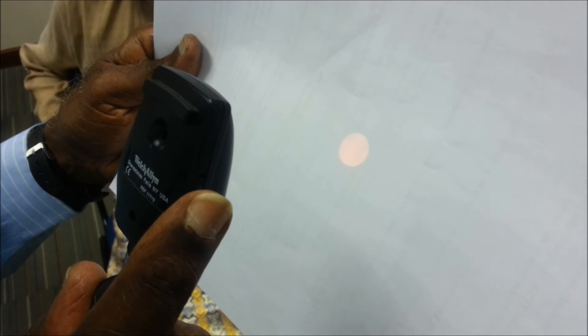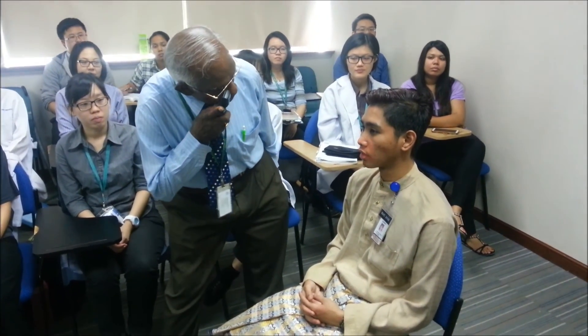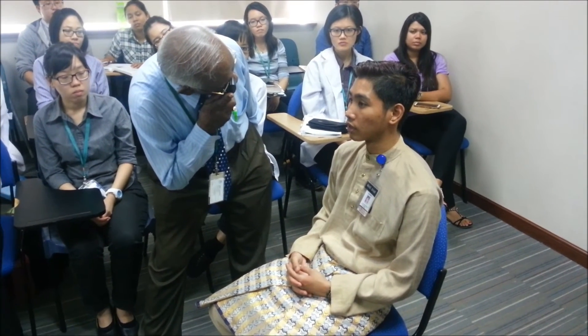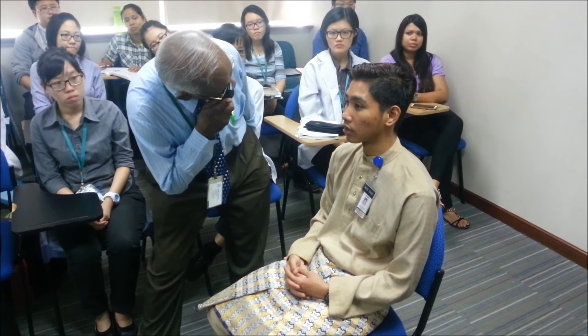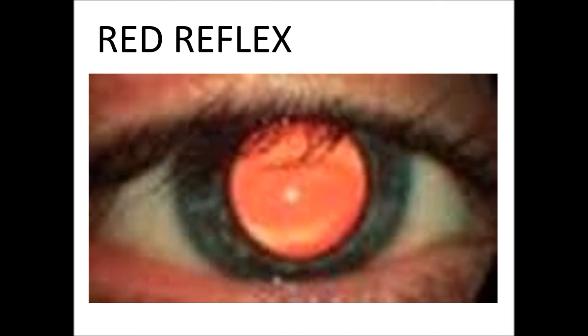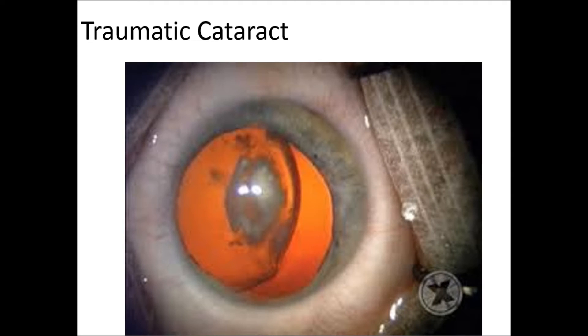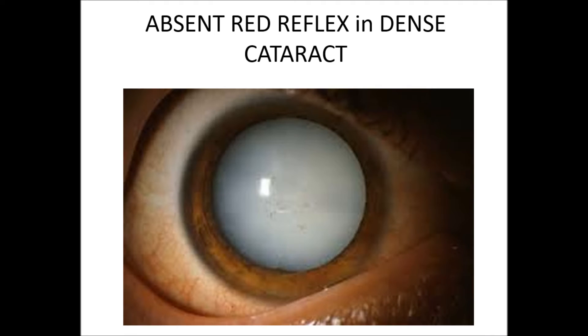This is the full aperture that the examiner uses. I am now doing the direct ophthalmoscopy on my patient. The examiner approaches the patient from a distance of a third of a metre, known as distant direct ophthalmoscopy, directing the illumination at the eye with the viewing lens of zero power, looking for an orange glow of light reflected off the retina. Medial opacities — for example, a corneal scar, a cataract or vitreous opacity — will show up as dark silhouettes against the red background. No red reflex will be seen with dense cataract, vitreous hemorrhage or retinal detachment.